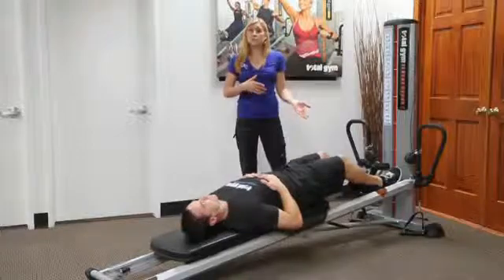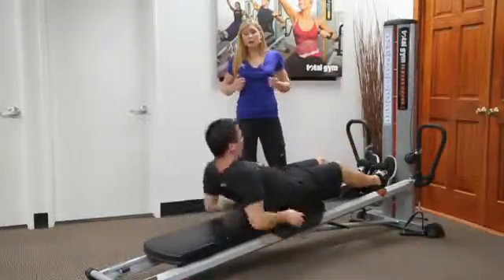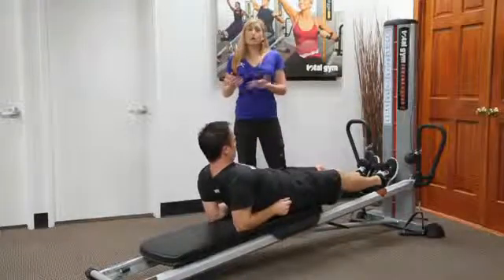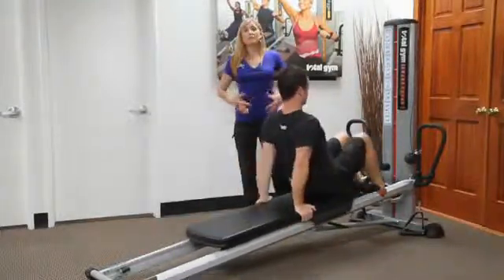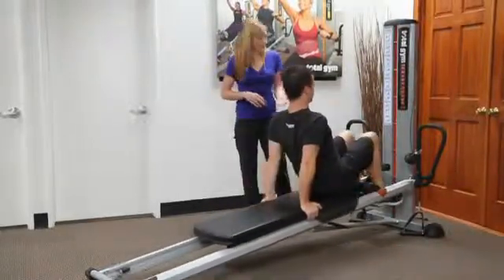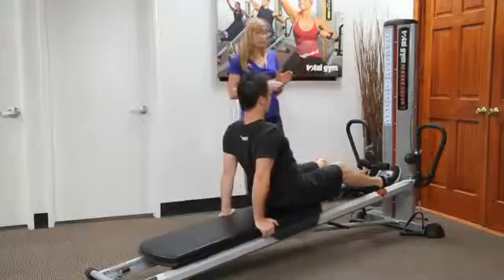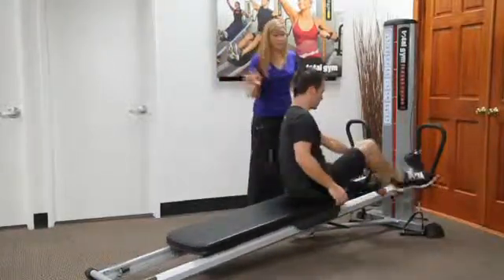But you want to be doing hamstring work. So option one is they can prop themselves up onto their forearms, and if they don't have the strength there, maybe they can sit all the way up. This does require a lot more core stabilization. What I've also been doing with my patients is I'm going to have you position your feet out of the foot holder. So he's going to turn his feet out, and he's going to come out.